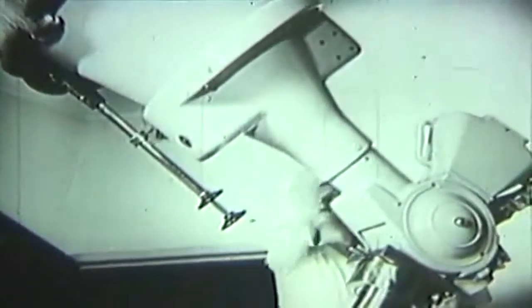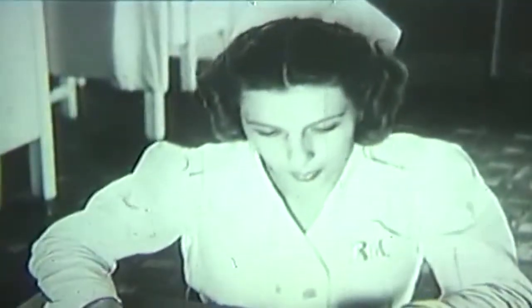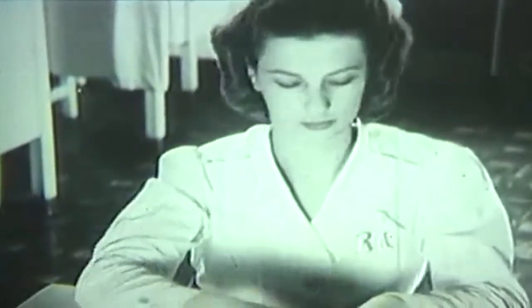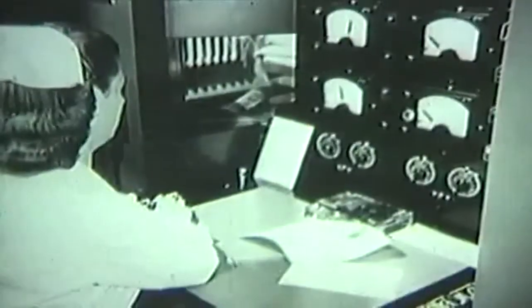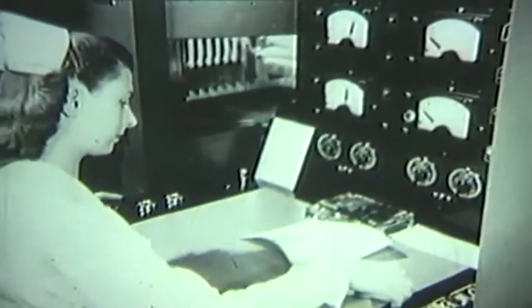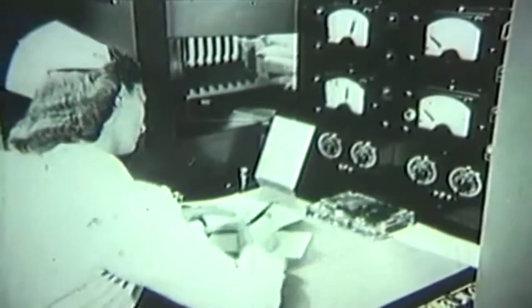A nurse technician who administers radiotherapy must have a precise knowledge of the equipment which she operates. She should also have an understanding of the physiological effects and psychological aspects of X-ray treatments upon individual patients. These qualifications are essential since the technician must cooperate very closely with the doctor, nurses, and others who are administering the medical and nursing care prescribed for each patient.